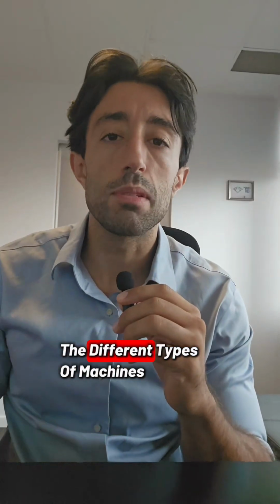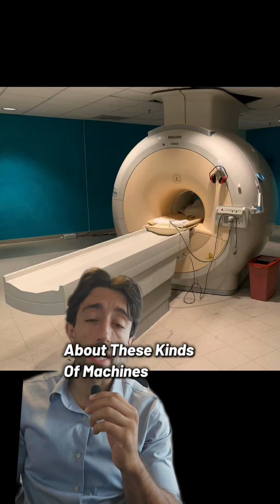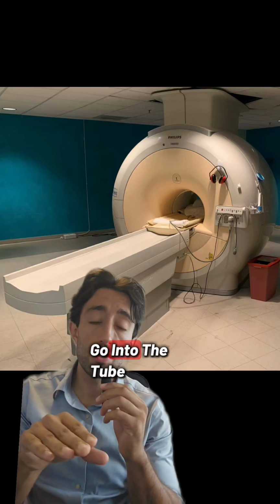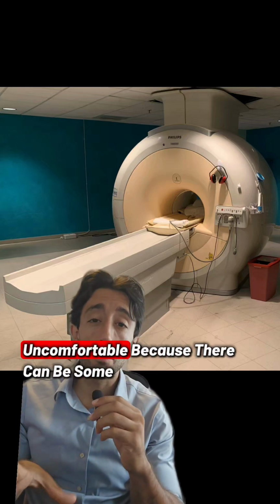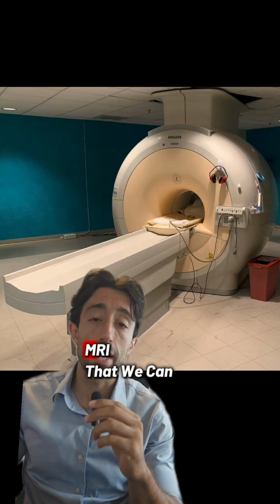Let's start with the different types of machines. First, we have the closed MRI. This is the one that most people will think of when they're thinking about these kinds of machines. This is the one where you go into the tube. Some people may feel a bit uncomfortable because there can be some claustrophobia, but it is one of the highest quality types of MRI that we can take.